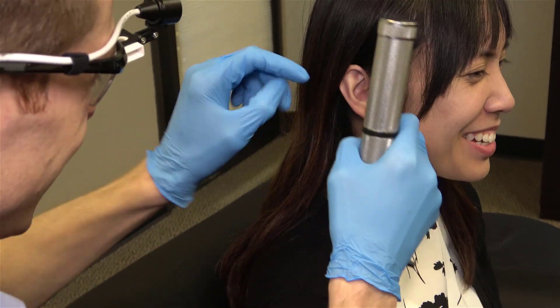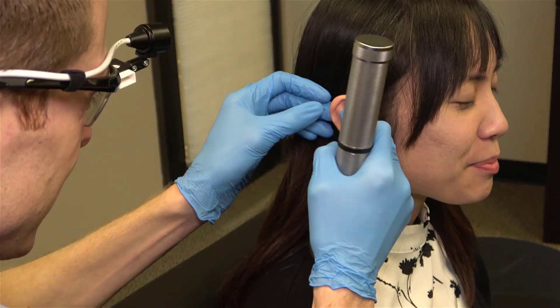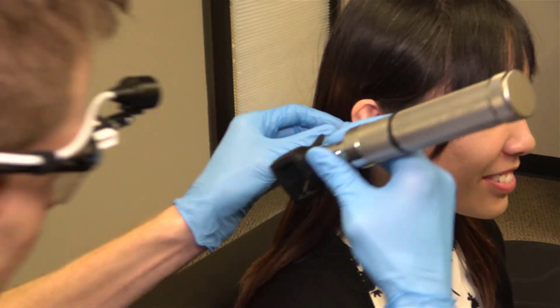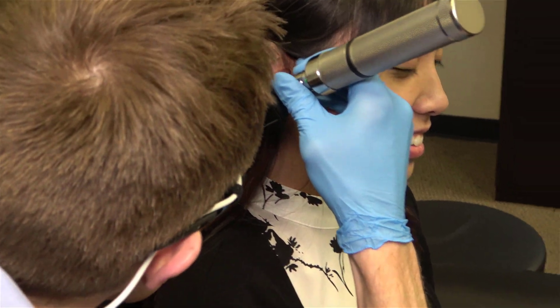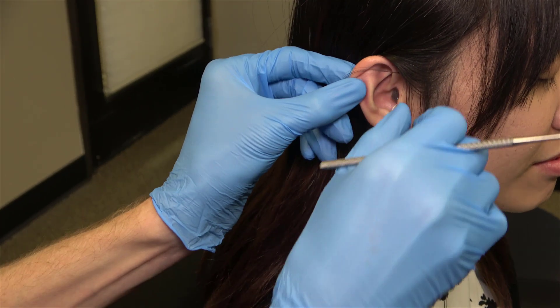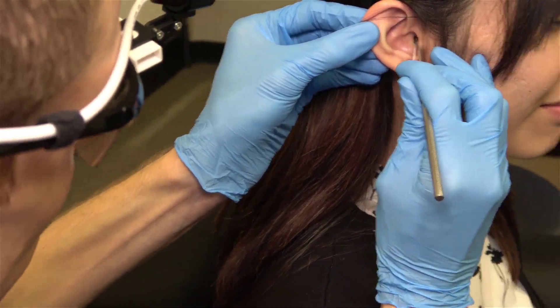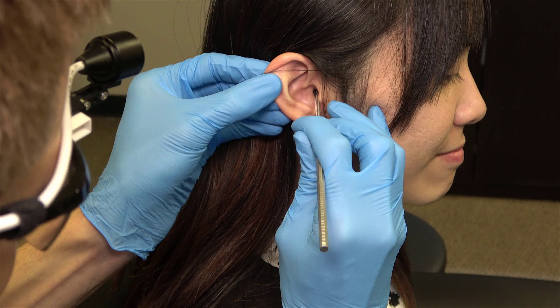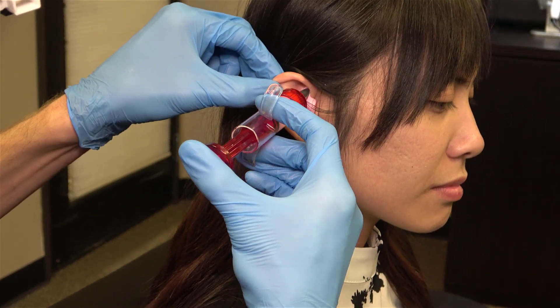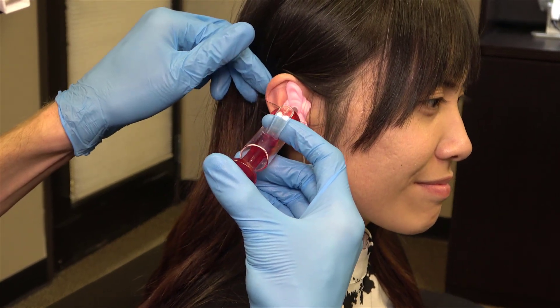I remember it like it was just yesterday. I had a young lady come into the clinic because she needed a swim plug for her ear to keep water out when swimming and showering. So I set her up to perform an ear mold impression. I looked inside her ear canal with my otoscope and everything looked completely normal. I then inserted a foam block to stop the impression material exactly where I wanted it, at the proper depth, and everything was still completely normal. When I injected the silicone compound into her ear to make the impression of her canal, everything was still completely normal. And I let it go about three or four minutes to solidify, and it was ready for me to pull out of her ear.